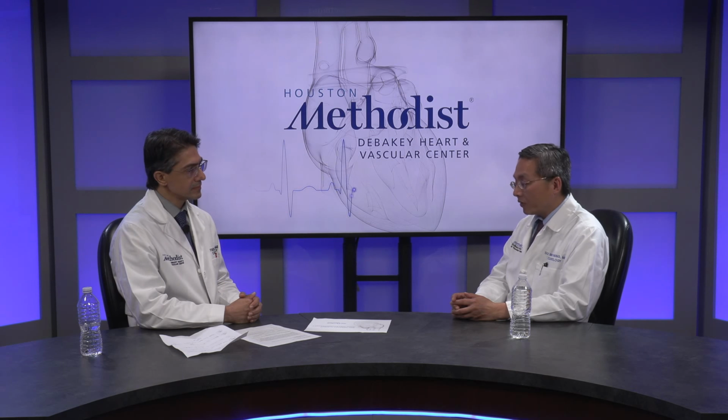And we believe, obviously, this is an association. We cannot prove this is causal, but I believe that's a very important aspect of why potentially using coronary CTA first could maybe improve patients' outcomes, because patients know they have disease, they have incentive to be compliant, and physicians are more likely to prescribe medication that we know could prevent heart attack and stroke.